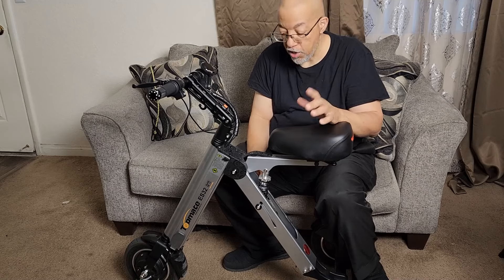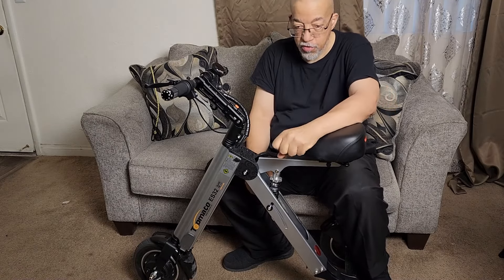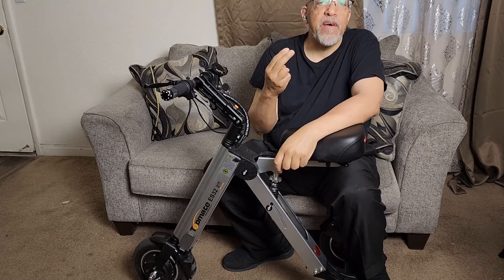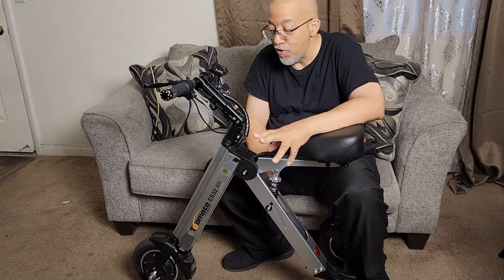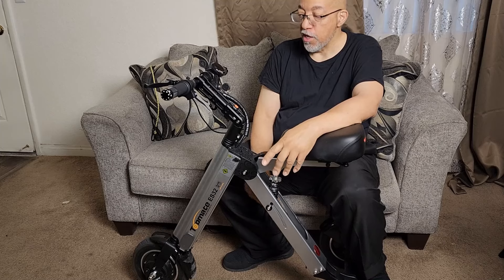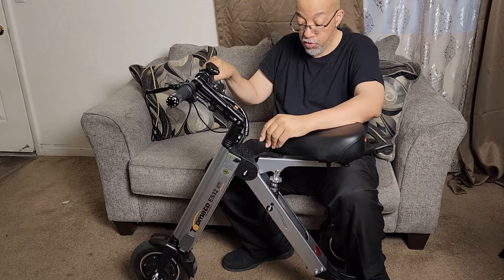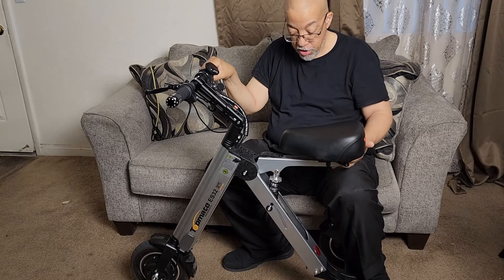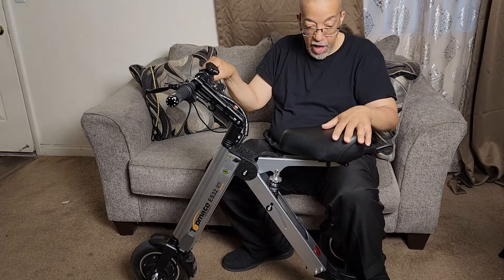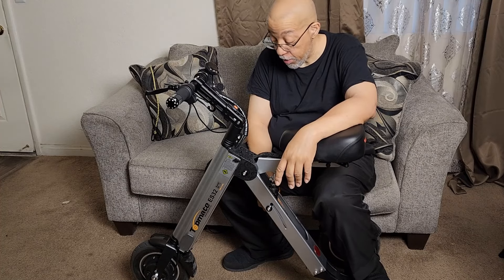It's fully electric and it's strong and sturdy, holds up to about 250 pounds — around 220 to 270 pounds — but it's very sturdy. It does have a hand brake, and all you need to do is tighten up the screws. There are a couple of screws under the seat that you need to check on every now and then. It doesn't loosen up or anything, but I do check on it anyway — it's a good idea.